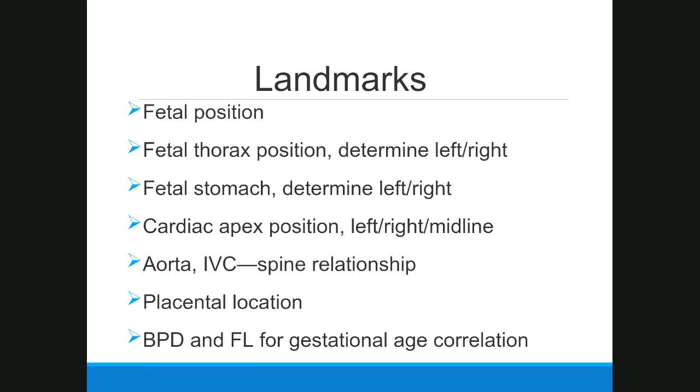From there, you always want to take a quick look at where the stomach is. So if the heart is in the normal location pointed towards the left side of the fetus, you should be able to scan just slightly inferior and see the stomach directly below the diaphragm. If you don't, give it a few minutes and see if the stomach may have just emptied and is going to fill back up. Or if you sweep down and you notice that the stomach is closer on the other side, then it's time to start thinking, okay, if I'm confident that the heart is on the correct side of the chest, but the stomach appears to be on the right, we want to make sure that we document that.